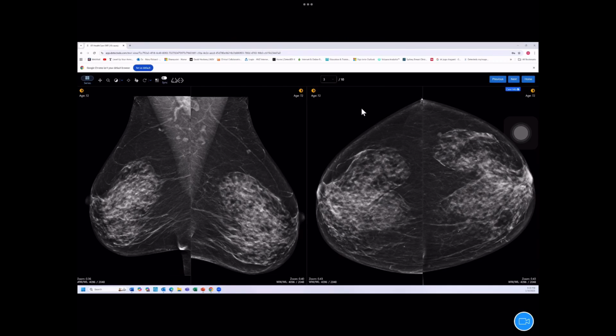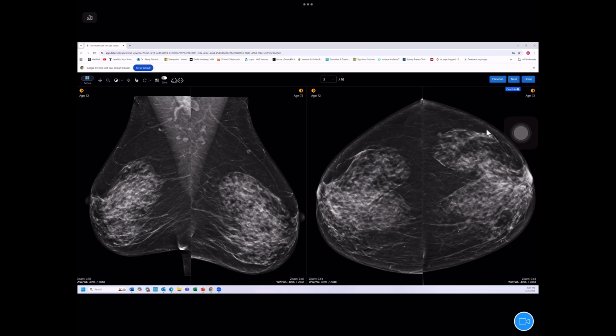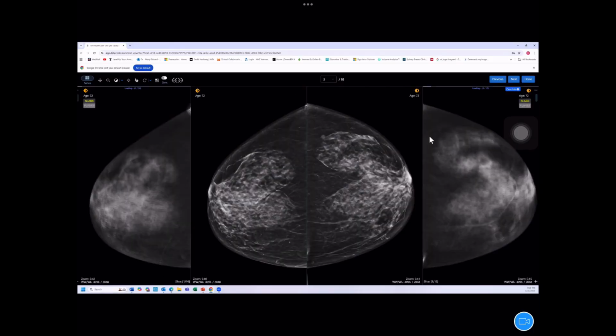And I guess I put it in because it does illustrate one of the issues of density, in that sometimes the density is non-uniform, isn't it? The density distribution is non-uniform. This is, I think, a high-density breast, probably going to be classified as a C rather than a D, because around the breast cone, you've got quite a lot of fat, this grey fat. There's quite a lot in here. If you were doing a Volpara inside the breast cone, anyhow, this is a high-density breast and should make it easy to see things on the tomo slices.